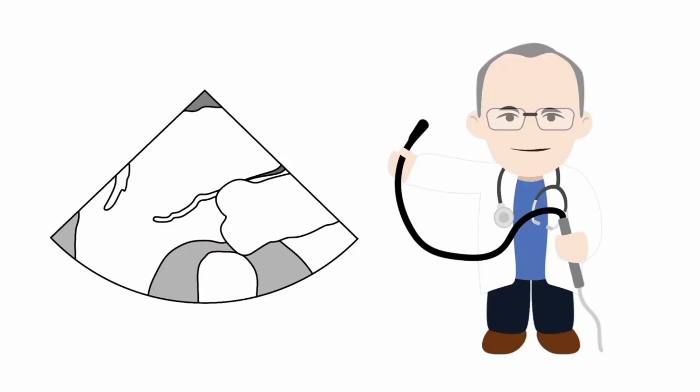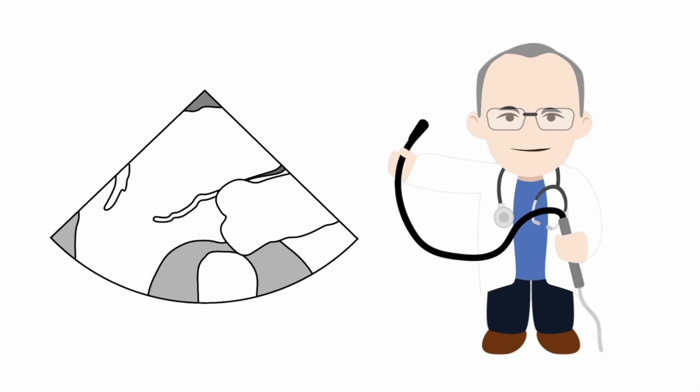In this lesson, we're going to learn how to obtain the mid-esophageal long axis view of the aortic valve.